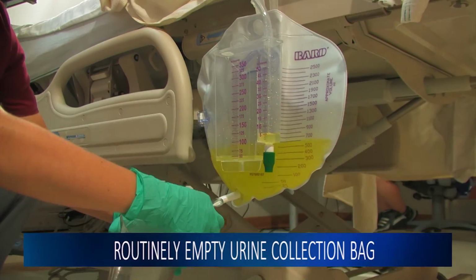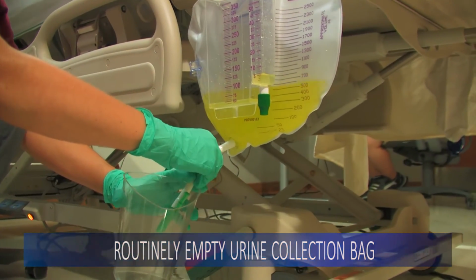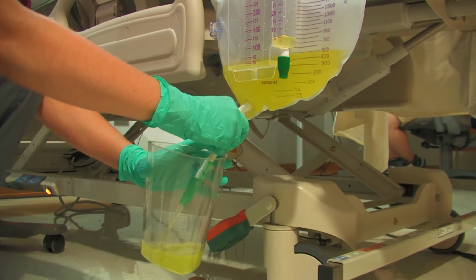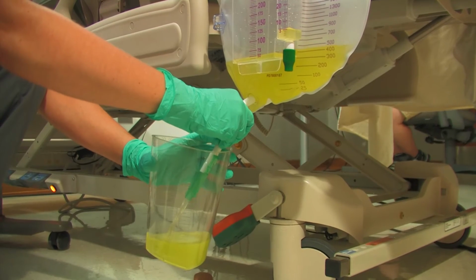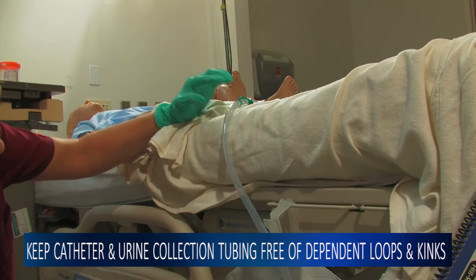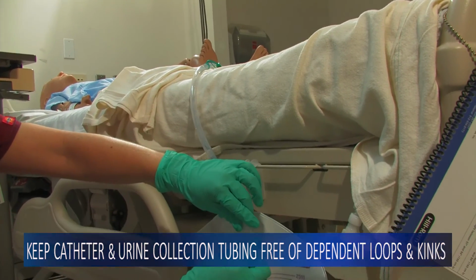Routinely empty the urine collection bag at a frequency indicated by your hospital's policy, when it is 1/2 to 3/4 full, and before transport or ambulation. Finally, keep the catheter and urine collection tubing free of dependent loops and kinks.